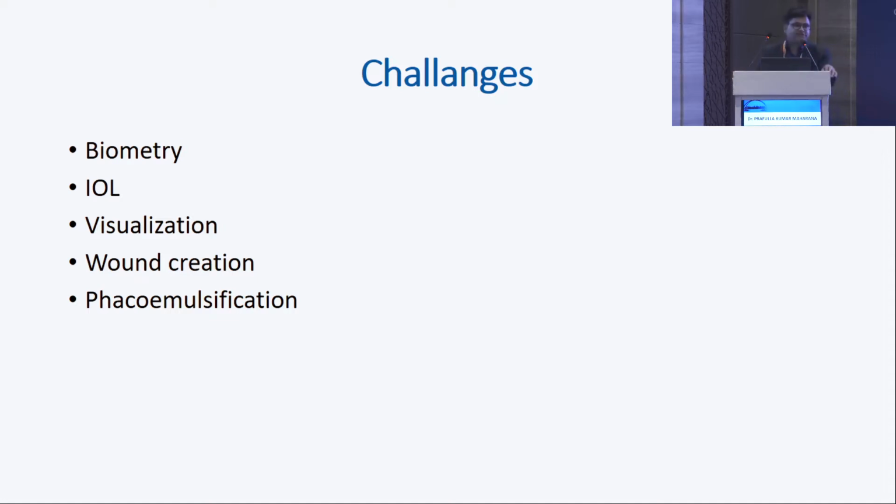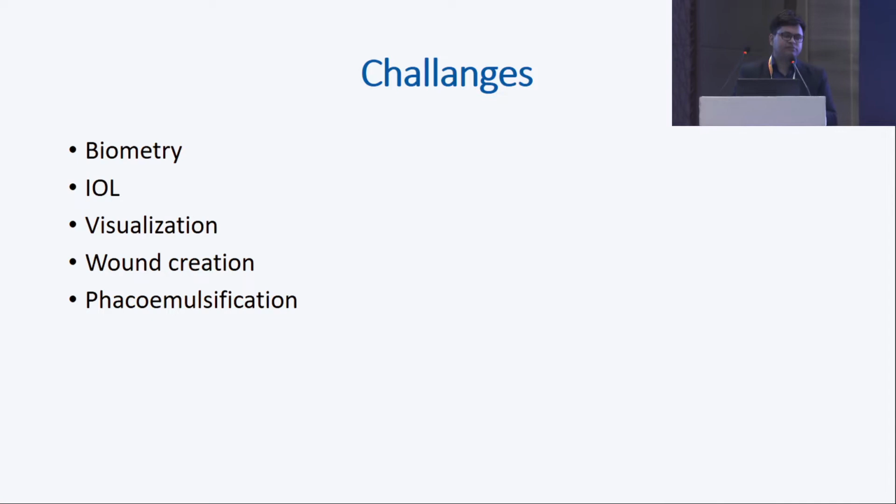During surgery, there are three main issues. First is visualization. Why? Because the cornea is irregular. At times there could be scar because of healed hydrops or subepithelial scarring. So visualization is a big problem. The most important part that I feel is depth perception. It gives you false depth. So that is a bit tricky while doing your posterior capsular polishing.